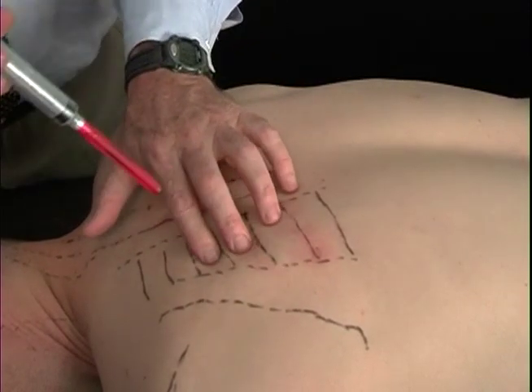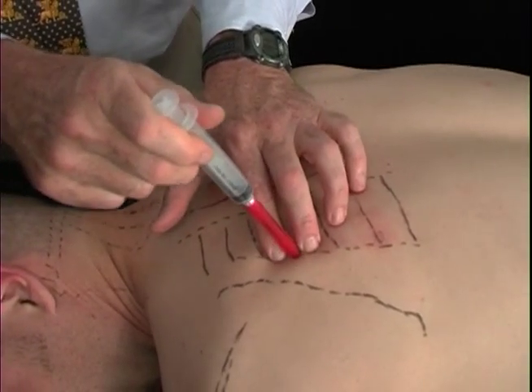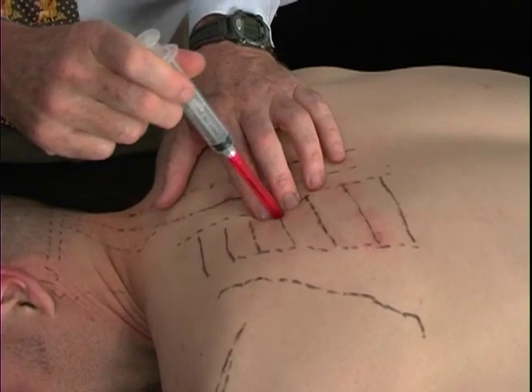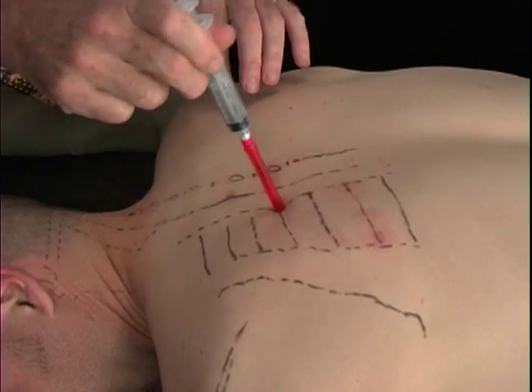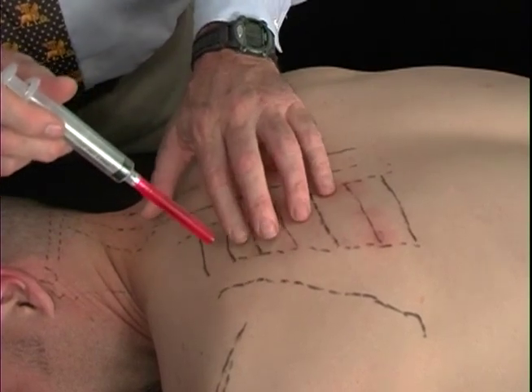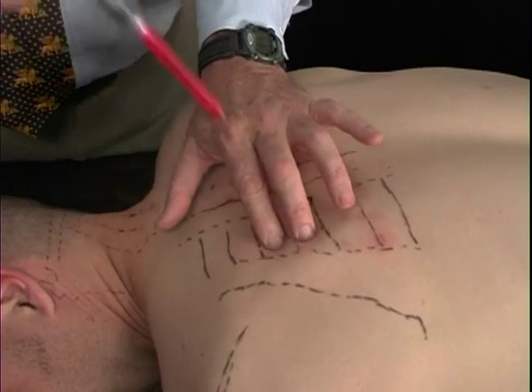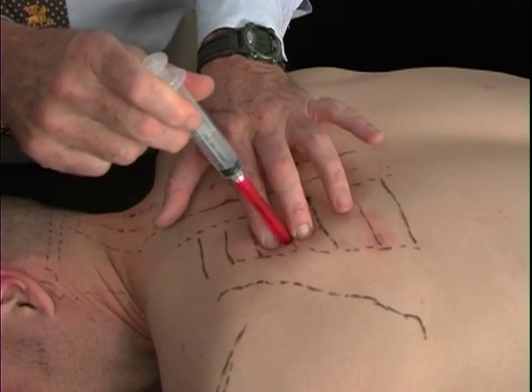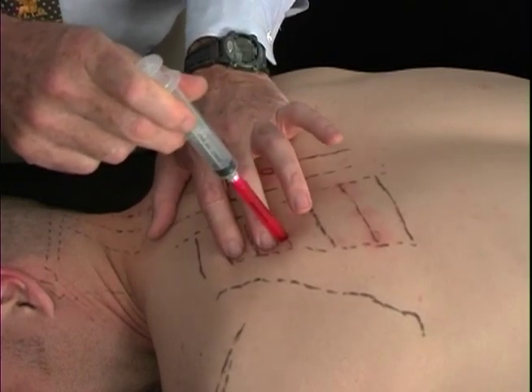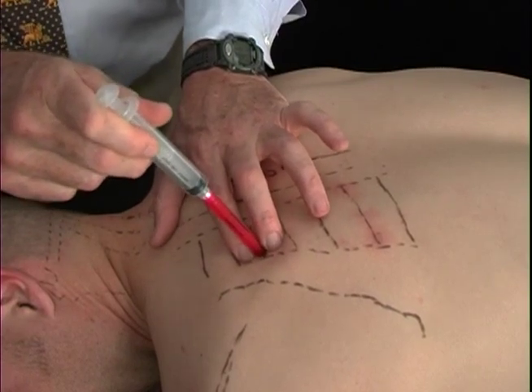We move right on up, and again, following that same procedure, coming to the angle of the ribs where we can feel it, and walking across the rib, do 3 or 4 injections till we get to the rib transverse process junction and inject that area. And we can feel his ribs, but we lose the rib right in here. So we know by this technique of coming in directly onto the rib here and then moving our fingers into the same hole that this finger was in, we can then move up and be confident that we're going to hit another rib here.